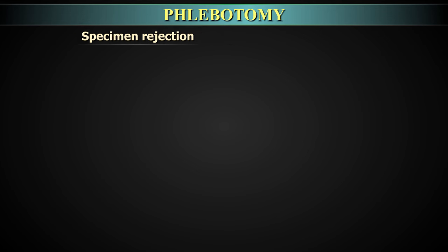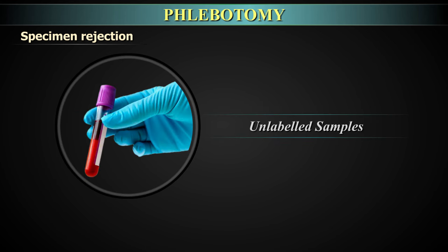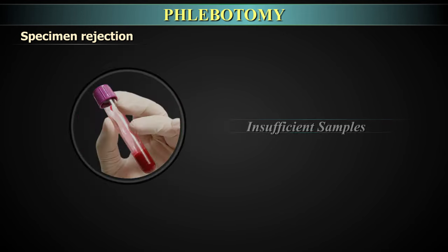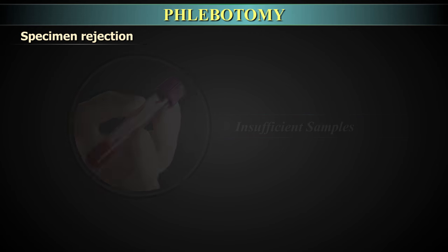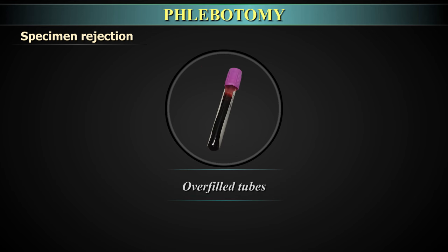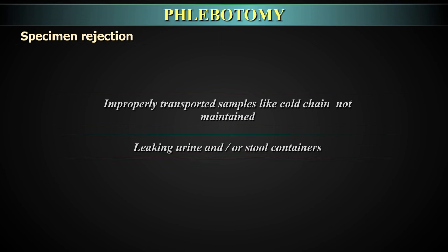Specimen rejection: Rejection criteria are designed to prevent inaccurate data and provide result accuracy. Criteria for rejection include: unlabeled samples, incorrect container or preservative, insufficient sample, suboptimal samples such as hemolyzed samples, EDTA blood with clots, overfilled or underfilled tubes, improperly transported samples where cold chain was not maintained, and leaking urine or stool containers.